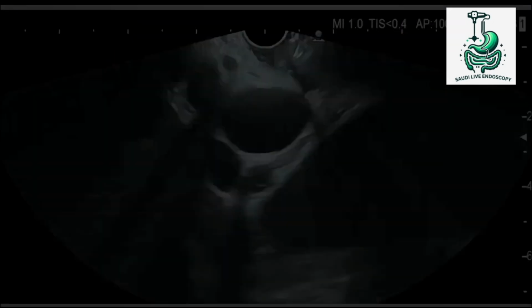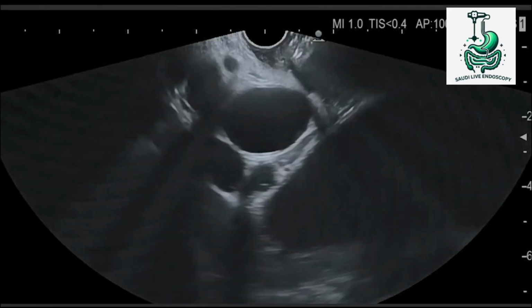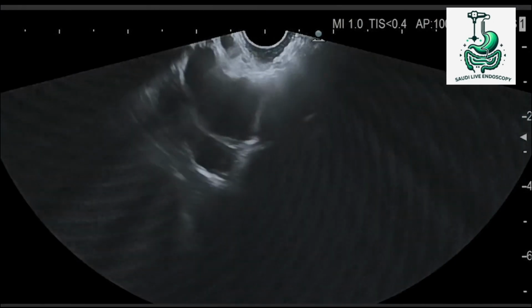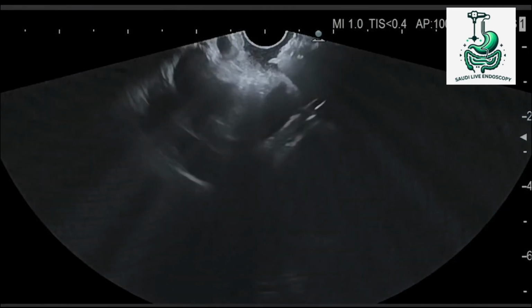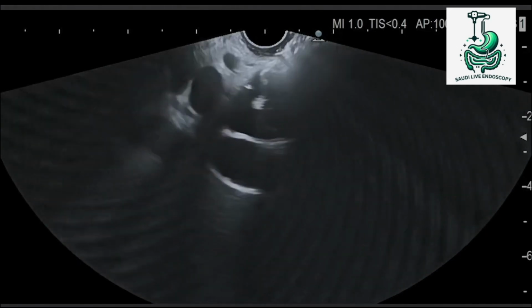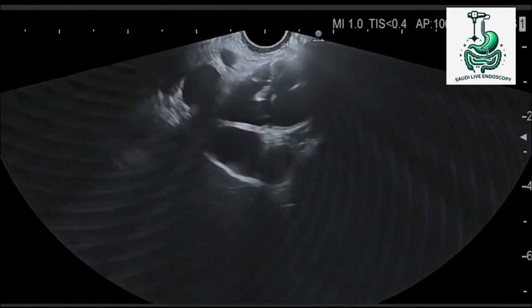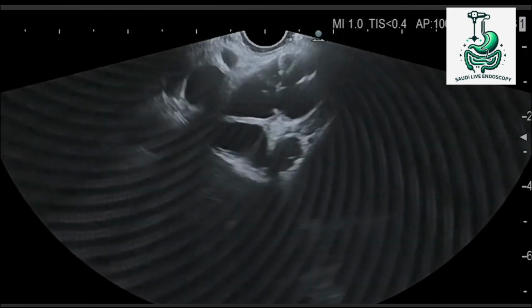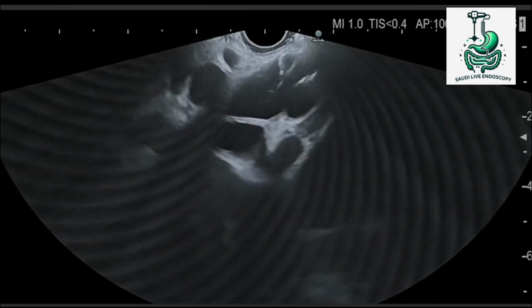Okay. And this is another case. So this is clearly a bile duct from the duodenal bulb. You penetrate with the Axios. Here, the Axios is open. Then you try to bring it back and release the proximal flange. But the proximal flange didn't work.